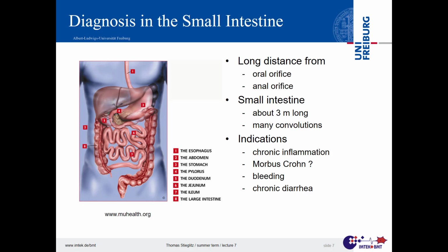And the idea was growing over the years: can't we travel with something through the intestine that gives us information? And that will mean we need some light, we need images, and at the very end, if we see something, we have to know where we have seen that. If you travel through and you say, you have something there, but it's just one spot, and you have no idea where it is, how to find that out. I mean, if you have to do open surgery, then, for example, to remove that, in the worst case, you will just remove that tiny little bit and not meters of the guts.